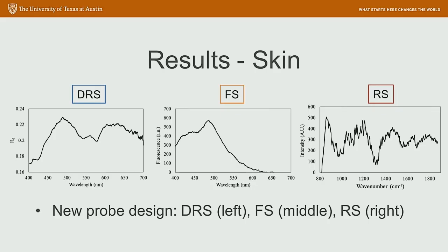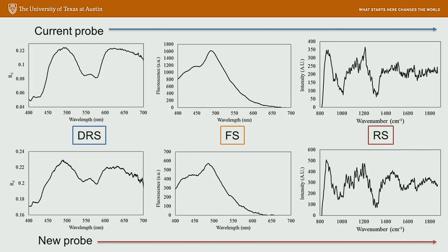With our new probe, the shape of the spectra also looks pretty consistent, pretty similar. And if you look at them side by side, you can get a better sense of how this looks. So I think we have some promising data that shows that the performance of these probes is pretty comparable.